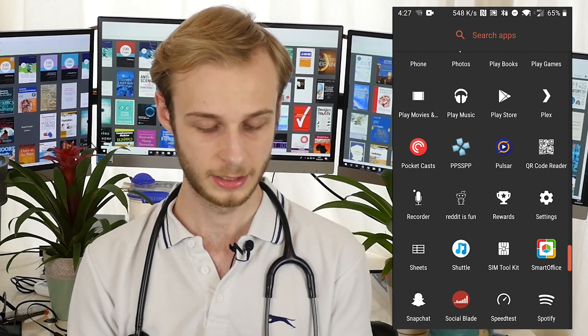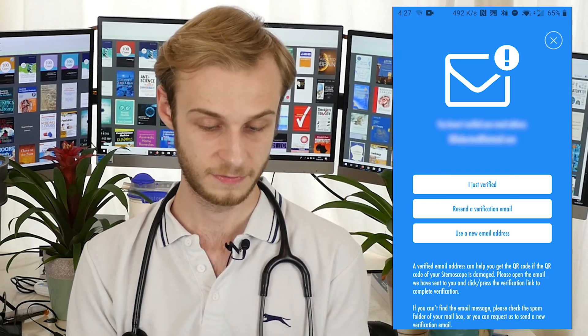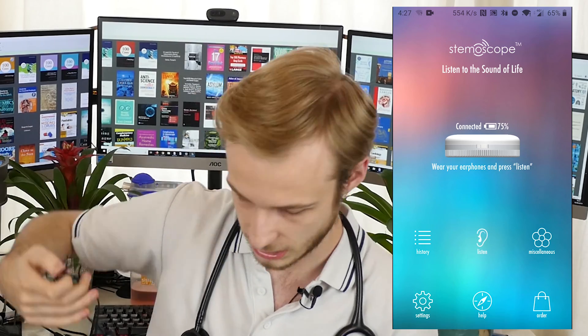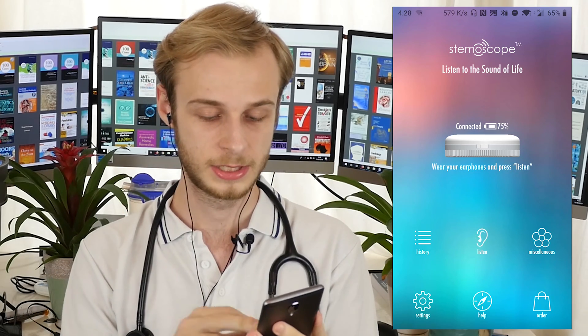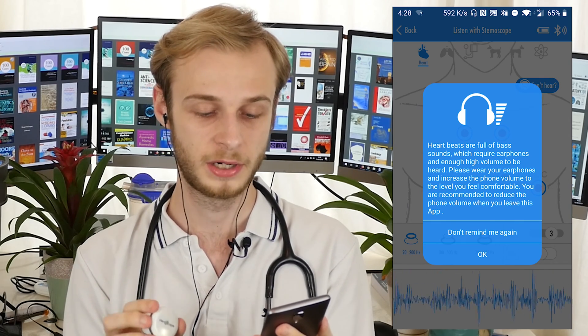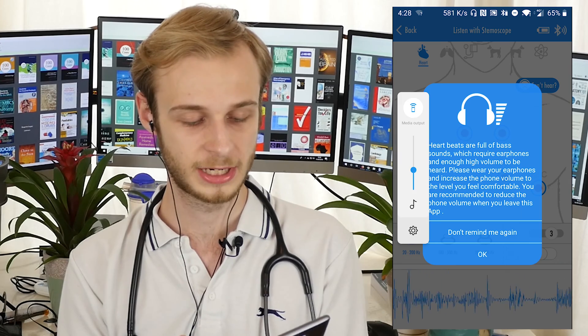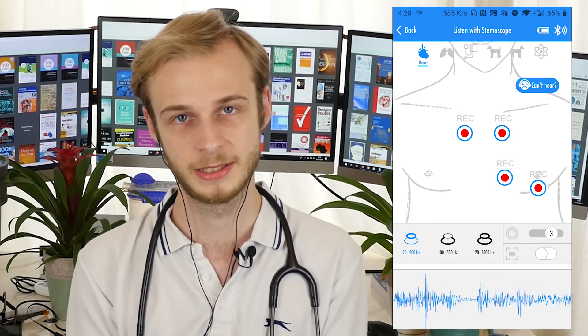So now I'll show you how easy it is to use. The first thing you have to do is turn it on, after which it will start to flash, which you can see there. Then we'll go ahead and launch the Stemoscope app. So now it's connecting, trying to find our Stemoscope — which it's found. You can see we've got it connected, and it's prompting me to put in some headphones. I'll put in my cheap wired ones and then press listen to get going. We get this warning: heartbeats are full of bass sounds, which require earphones and enough high volume to be heard. Heart sounds are really bass heavy, so I would actually turn your volume down slightly before you begin using it, just so it doesn't deafen you, because it is quite sensitive.